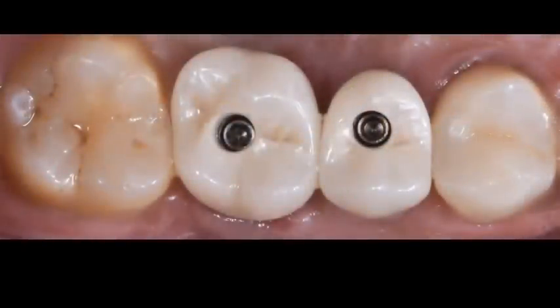So now what I'm going to do is what we all do. We try in the crowns, we sit them, we adjust the occlusion, we highly polish them. Now I have these access holes to restore. And whenever I can, I like to restore these access holes to natural looking restorations, because I know we have the materials today to do so.